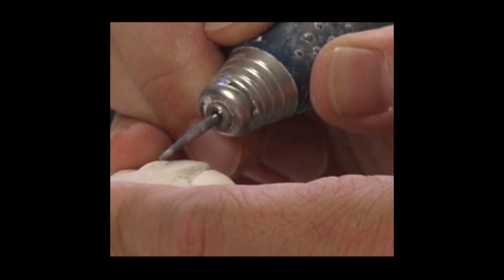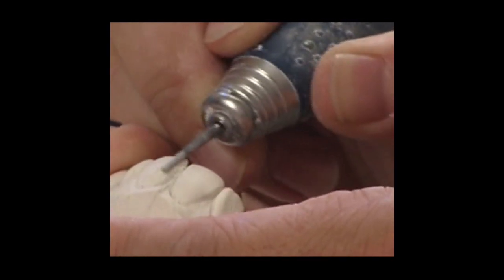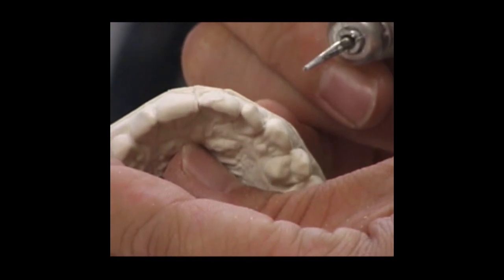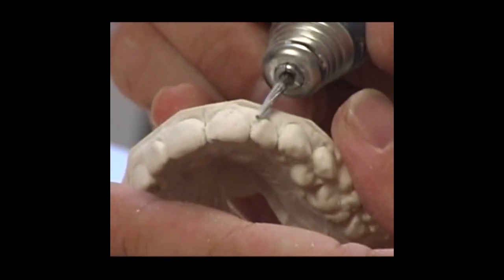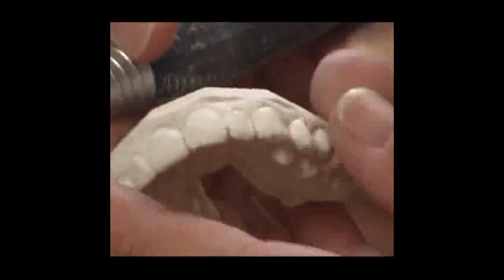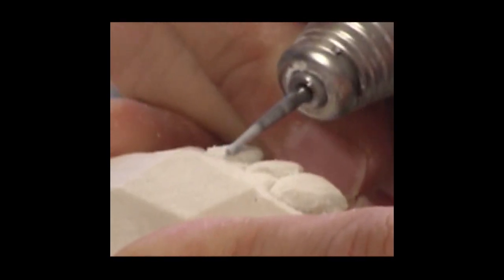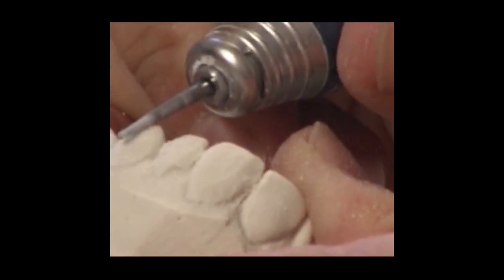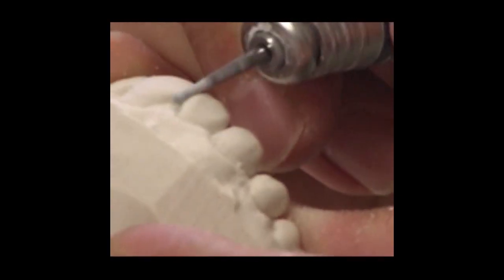Now we're going to have a little bit of facial reduction. It doesn't have to be accurately removed like we do when prepping. It's just the preliminary area that we need to do. Number 9 medially was sticking out, so I just brought it in a little bit so we have an idea where we're going. Height of contour on number 10 is also a little bit too bulky, so we want to push it in a little bit. And number 11 also sticks out a little too much. We're going to remove a little bit. Number 6 is also labially bulky, so we just bring it in.